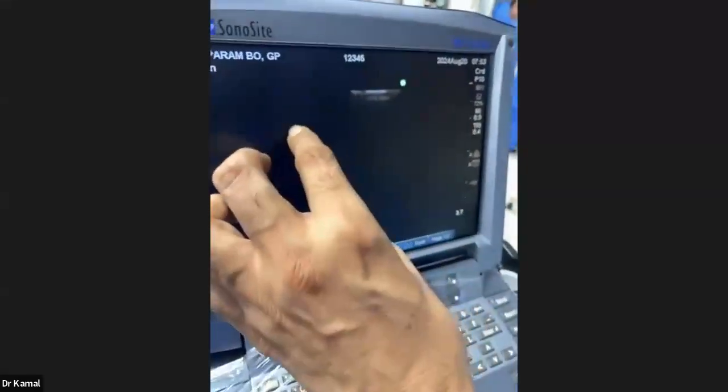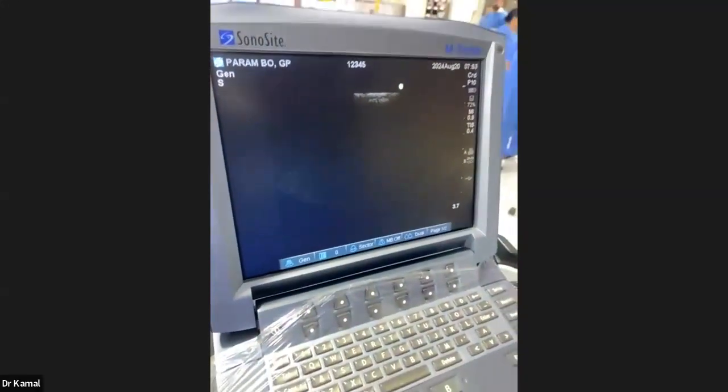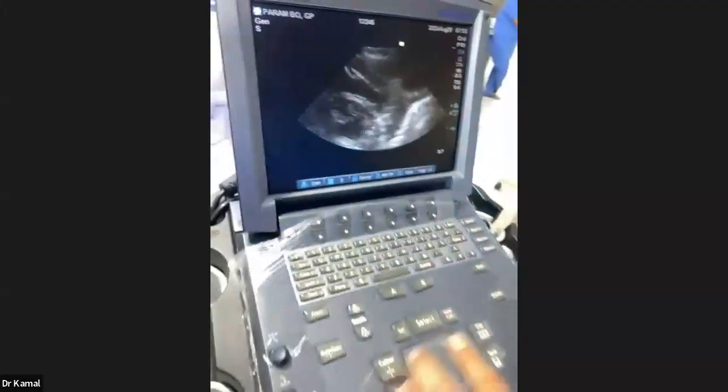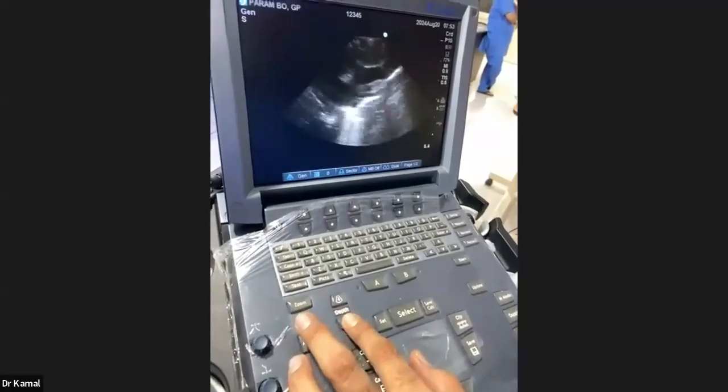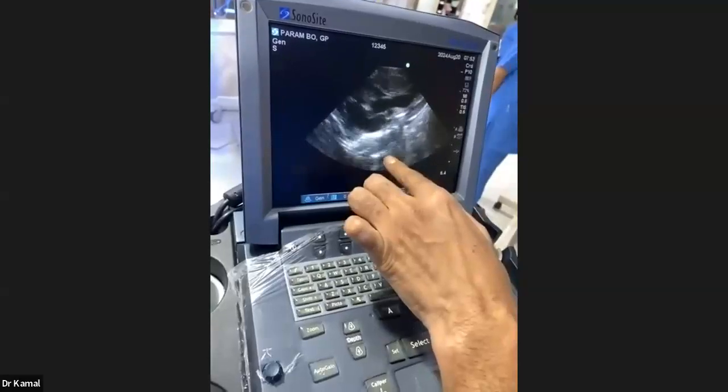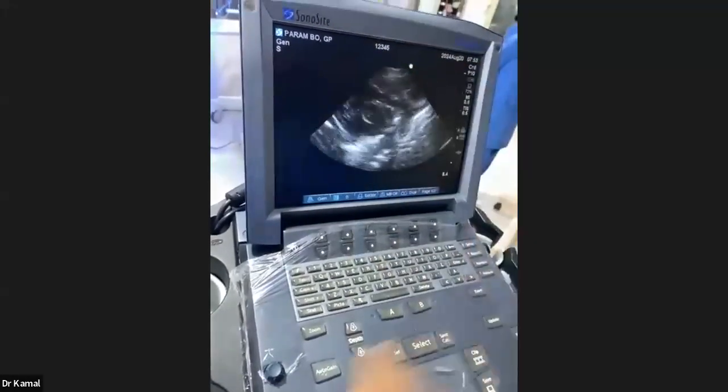Dr. Jamal is asking, can you please explain gain and depth once more? Gain and depth. Yes, sir. Just see this practically, which sir told you yesterday, and Dr. Sajan sir also told you yesterday. Gain means I'm gaining the sound signal from that particular point. If I'm interested over here, I'll just decrease it. Okay. If I'm interested in this point, I'll try to gain from this place.